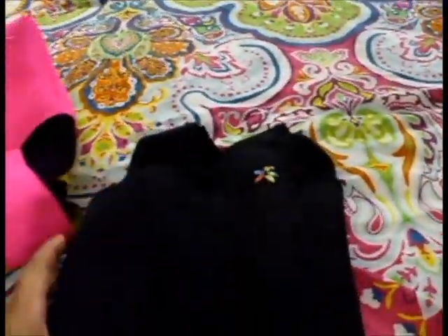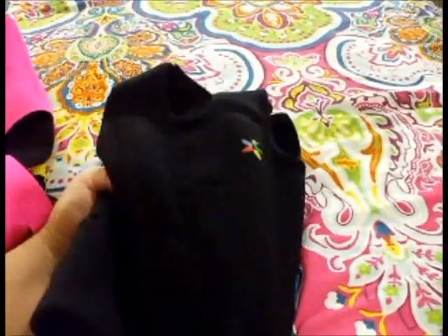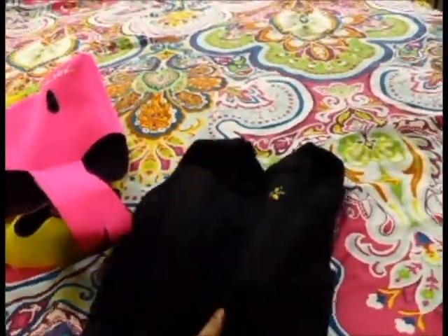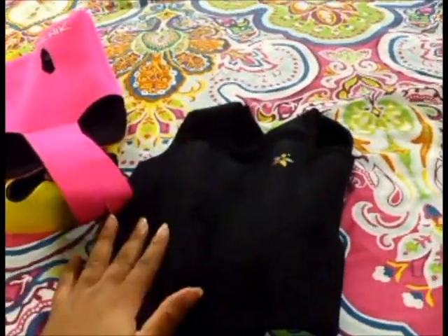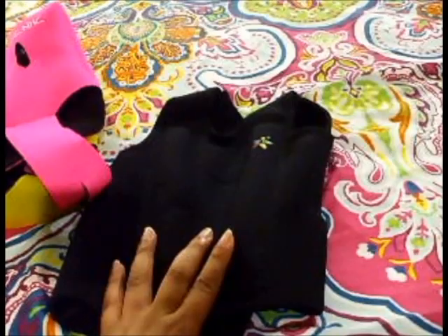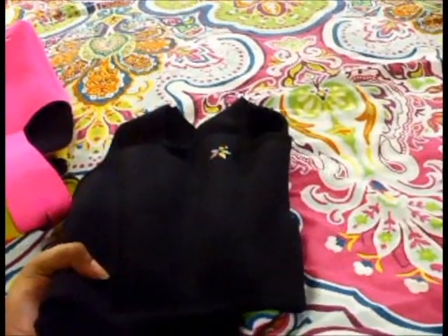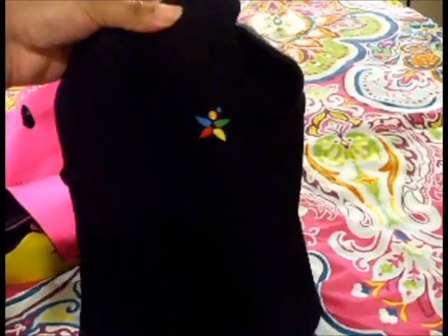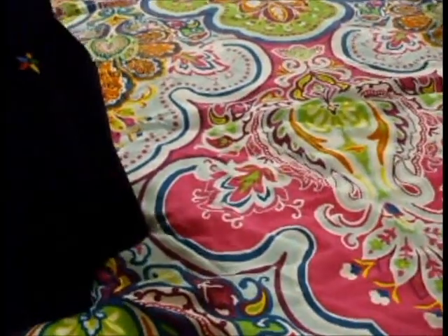And then this latest piece of equipment here that we got is a weighted compression vest. I think it's called a Spio. And we use this typically more so when she's having what I call one of her meltdowns. Like I said, she does love deep pressure, so I will put this on her, and it really does help. It will help her start calming down. Probably takes a few minutes because she fights me when I'm trying to put it on, but otherwise this was a very helpful piece of equipment, and we do continue to use it as she gets bigger if we need to get it resized.